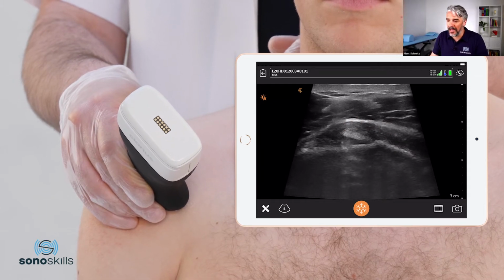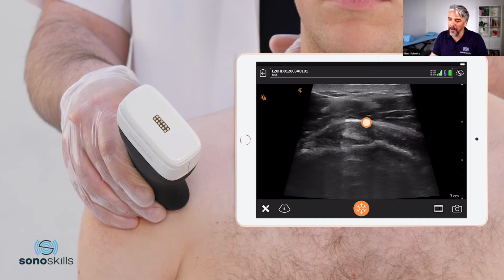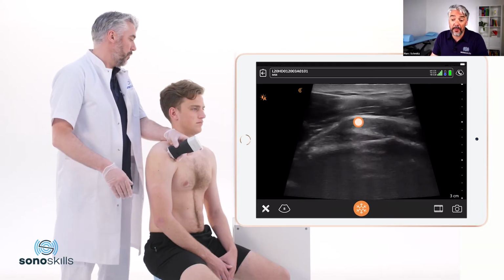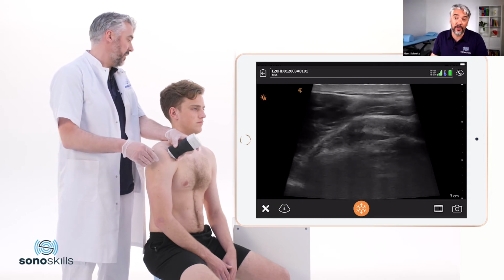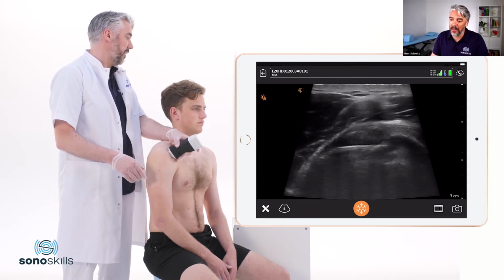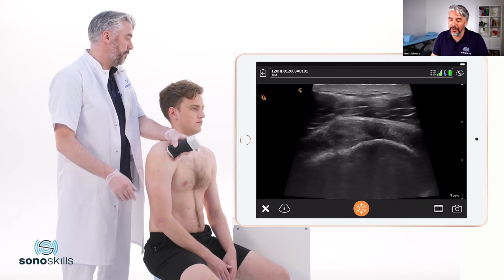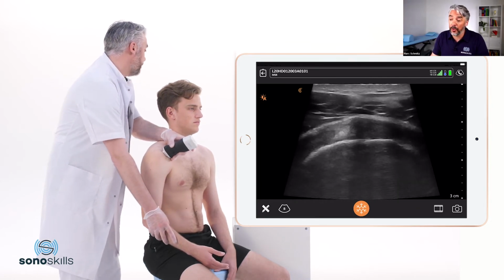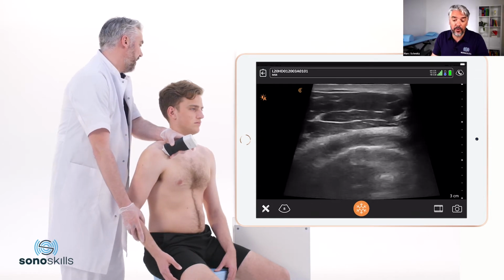Superficial to the coracohumeral ligament, we can find the subacromial subdeltoid bursa, which cannot be seen right now because this is a healthy bursa. But if pathology is there, then definitely you can see an effusion within the bursa. Next to the static imaging, we could also do dynamic imaging.